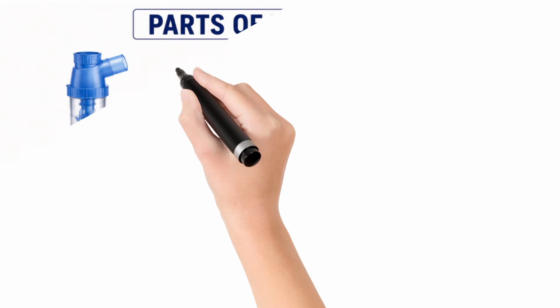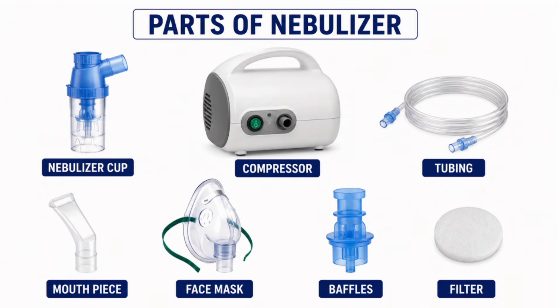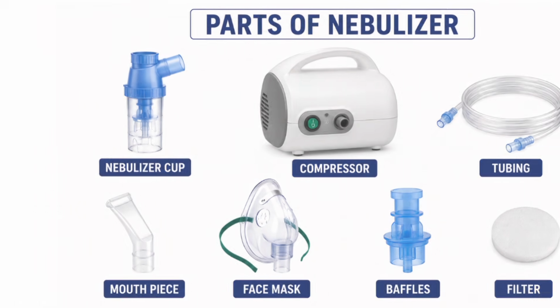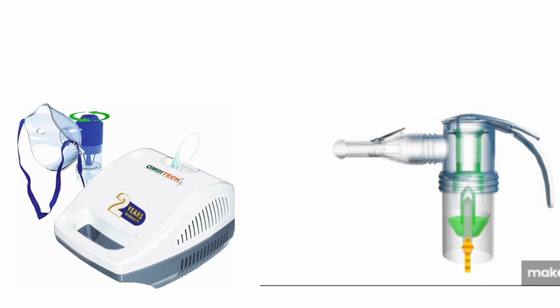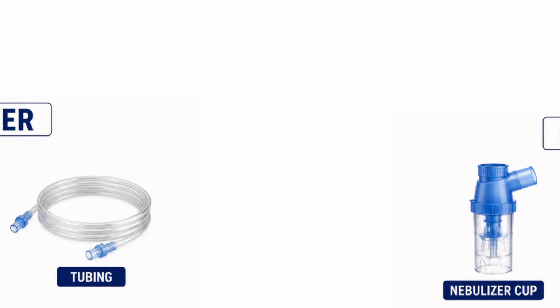A nebulizer mainly has a compressor or base unit which houses the motor or pump. This compressor creates compressed air, so that whenever it is on, it converts the liquid into air particles or aerosol. Another important component is the nebulizer cup or medication chamber, in which the liquid medicine is poured, and the tubing, which connects the compressor to the medication cup.